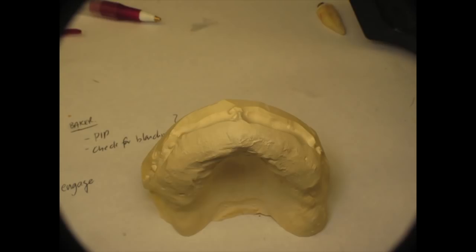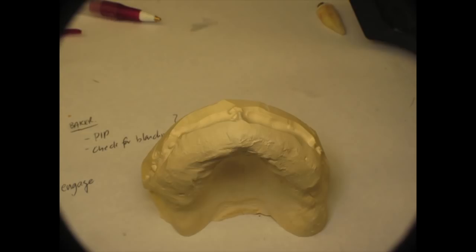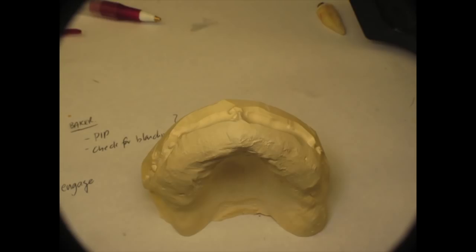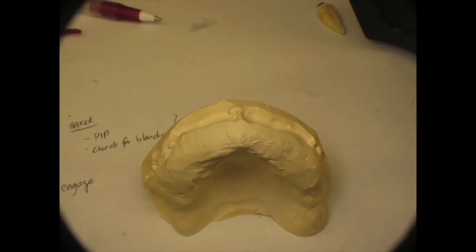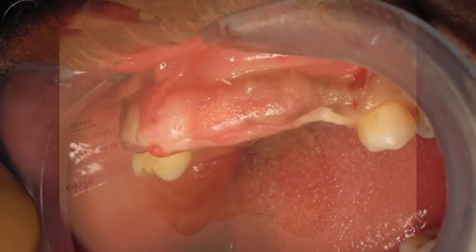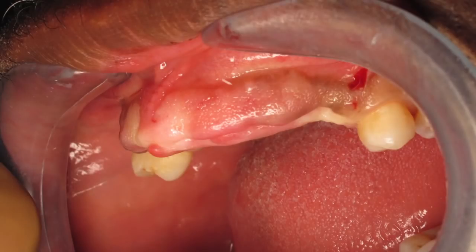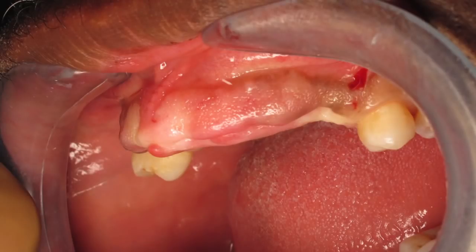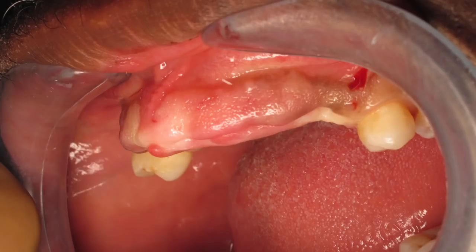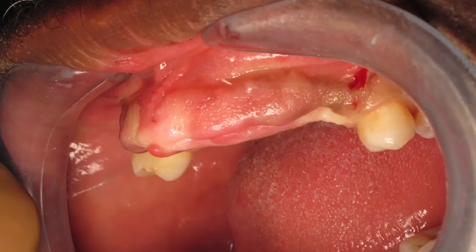What you see in front of you is a cast that's been surgically modified — some stone was removed in an effort to predict where we want the denture to sit. I fabricated a stent on this that you'll see being used intraorally. This is the ridge preoperatively. It is fairly far anteriorly positioned, and we want to be able to place teeth in an aesthetic manner and also provide him lip closure.